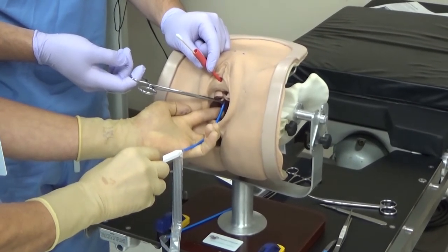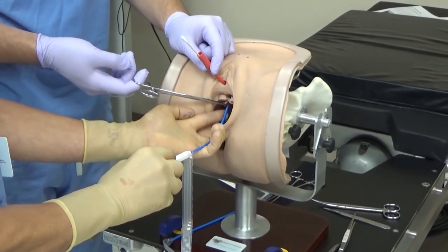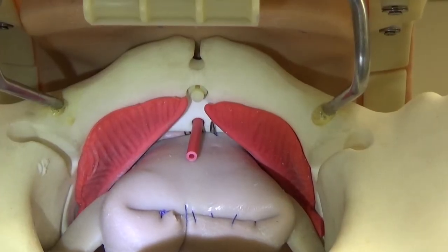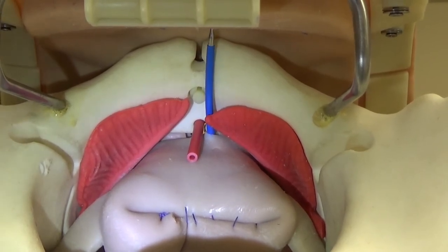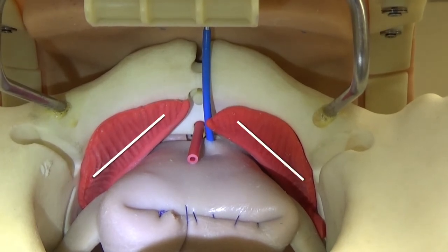Note the position of the hand supporting the trocar needle supplies almost all the force for the trocar passage. The trocar is passed cephalad, hugging the backside of the pubic bone as shown. The red represents the obturator internus muscle, and the ridge is the arcus tendineus fascia pelvis, or white line, which extends down to the ischial spine.